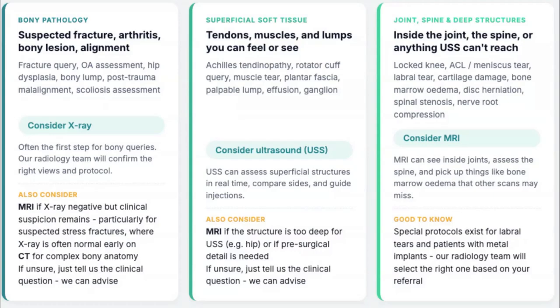I've just done one patient who came to me with a swollen finger, just a middle finger interphalangeal joint. That's the only thing she's got swollen. She's been sent in by the hand surgeons for an ultrasound scan. She had florid synovitis, some inflammation of that joint. But in addition, on the ultrasound, I could see that there was degenerative change, some osteophytes, some new bone formation.